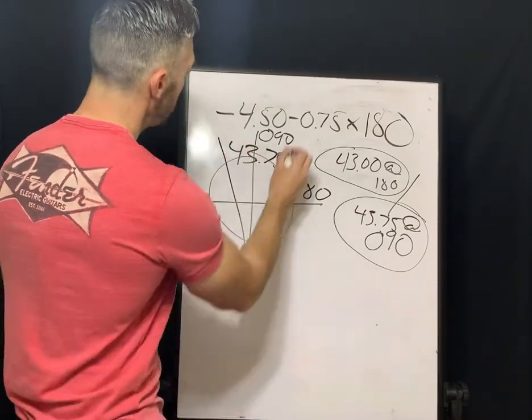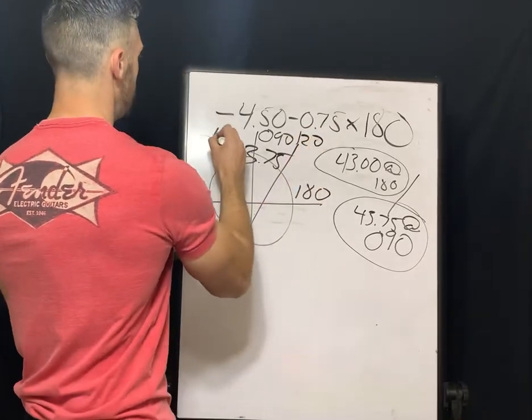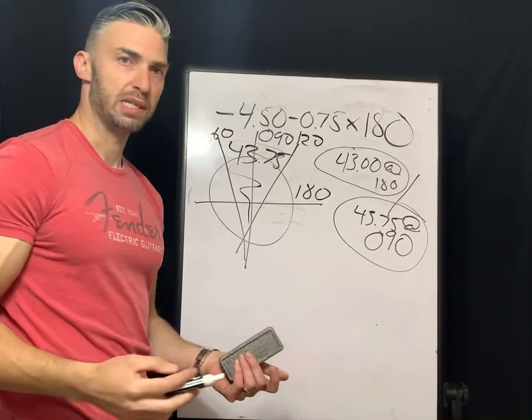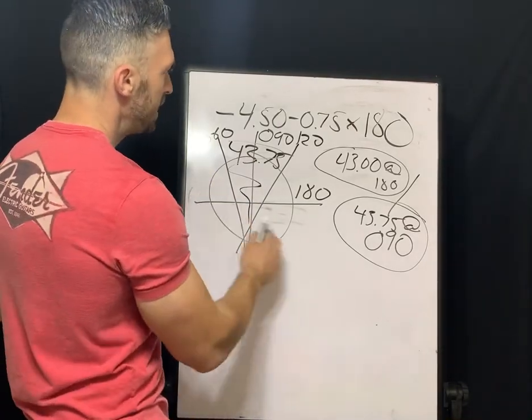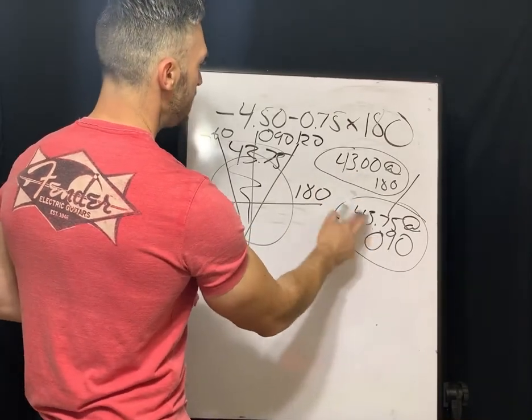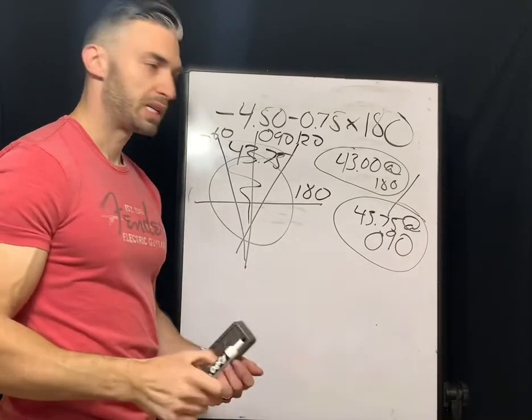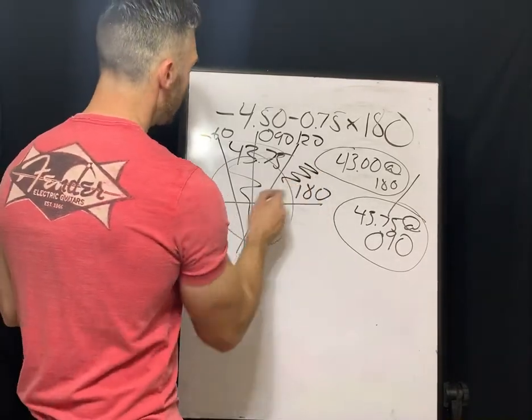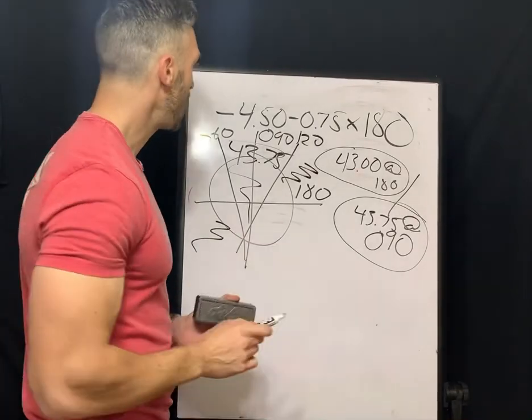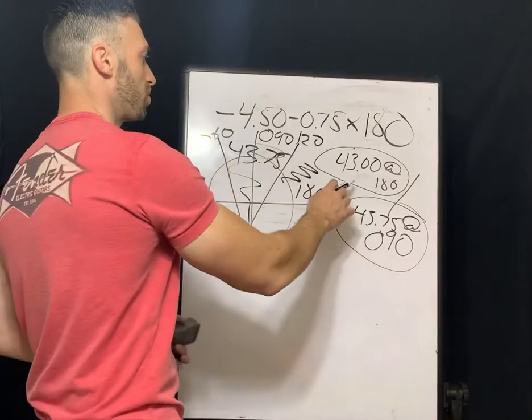If you're within 30 degrees of 90, if we did 120 and 60, if your steeper power falls in that range, it's with the rule astigmatism. And oppositely, if this was 43.75 at 180 and 43 at 90, your steeper power would be on the horizontal. You'd call that against the rule astigmatism. And then if it fell in between those, it would be oblique astigmatism. But I digress.